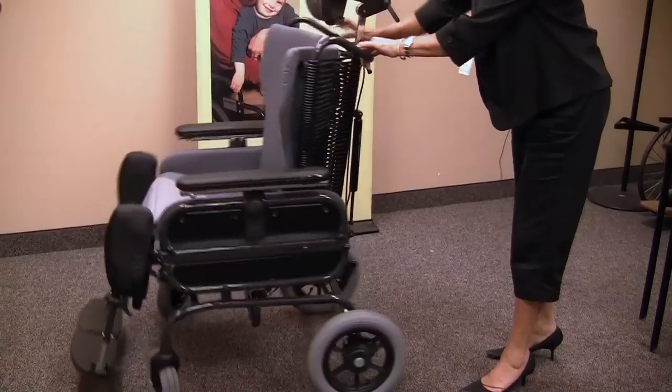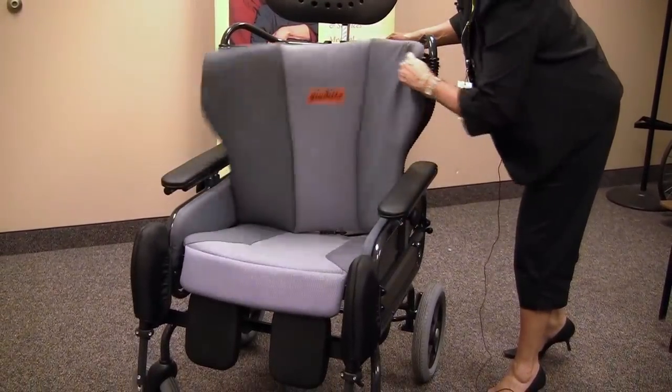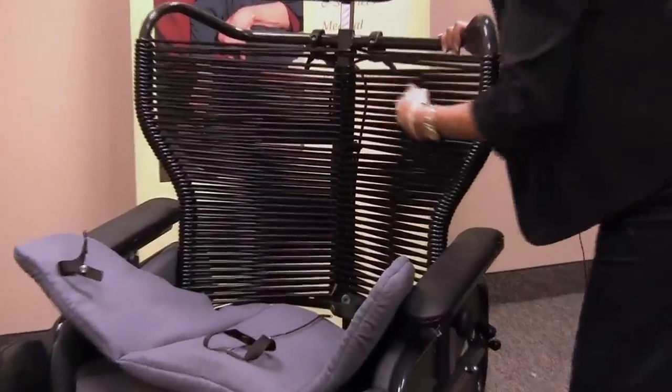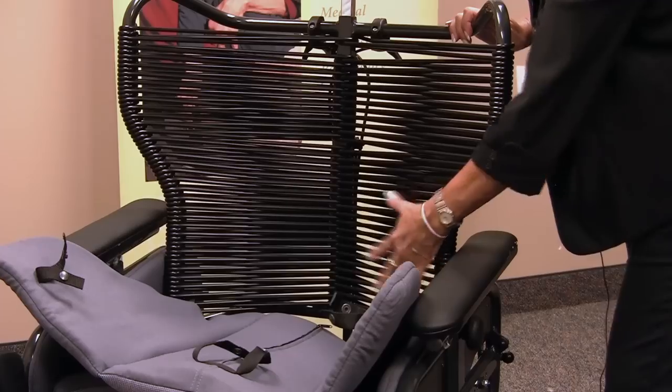All of the pads on the Judy chair are removable and washable. The back and seat consist of an interwoven pliable tubing to provide excellent distribution and positioning for the client.